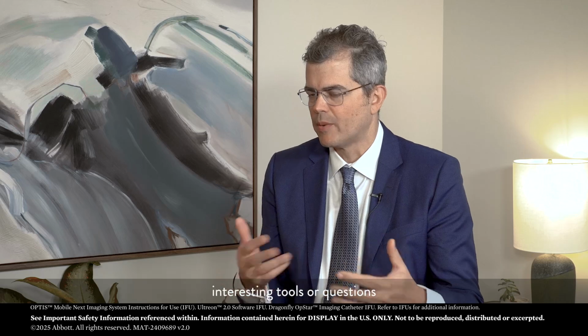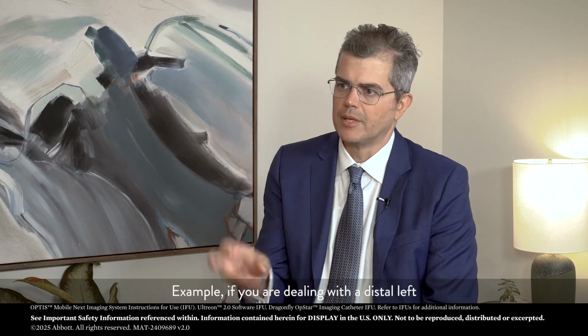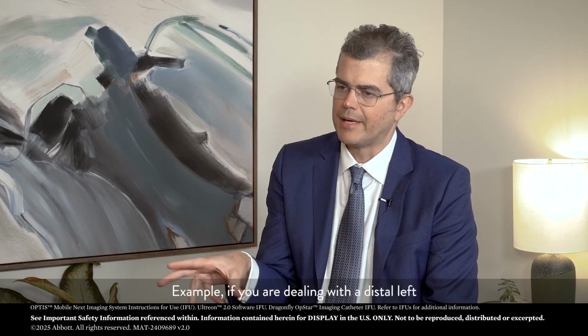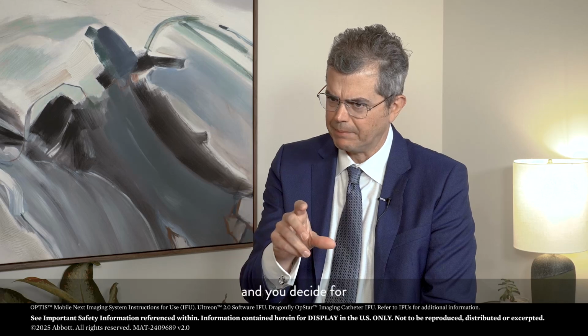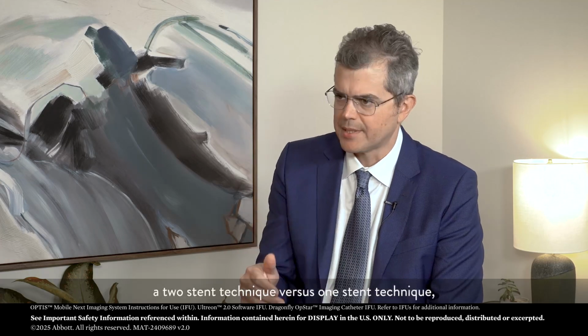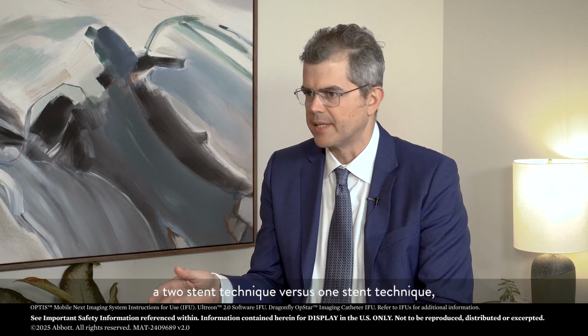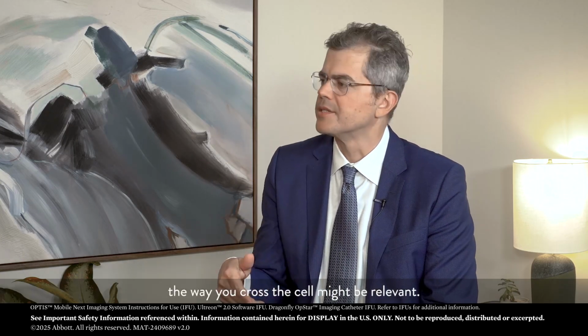Sure. I think the larger the branch becomes, there are some interesting tools or questions that you can answer through OCT. For example, if you are dealing with a distal left main bifurcation and you decide on a 2 stent technique versus 1 stent technique, the way you cross the cell might be relevant, right?